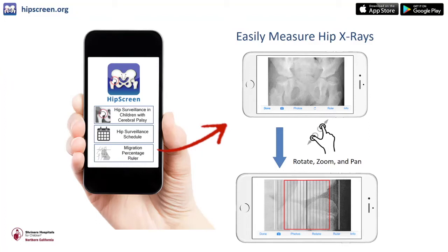Now, if you already have a photo on your device, you can upload it to the HipScreen app, but it doesn't change or modify it in any way. It's important to keep in mind that you should follow the privacy laws of your country and not photograph any patient identifiable information on any personal devices. But these features that were built into HipScreen to help with the privacy protection can help allay some of the fears.